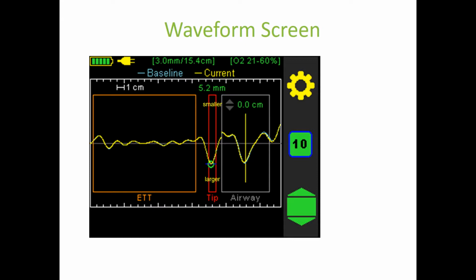And the farther down that echo goes into the tube, the larger the trachea is. If it was smaller, then you see it at the top, such as if it was in an esophagus even, you would see the echo going upward. We're going to focus most of our time on this box, however, and it kind of looks gray-blue when you look at it on the screen. And this is an echo that's coming from the lung. I'm going to give you some things to think about, because this is going to feel backwards to you as you're thinking about it. But let's start with this.